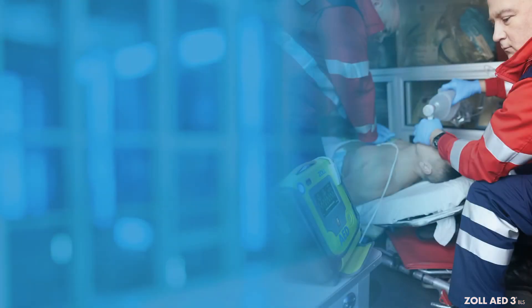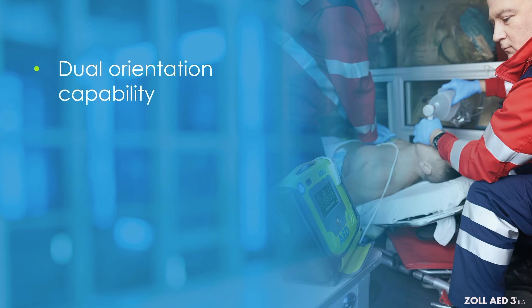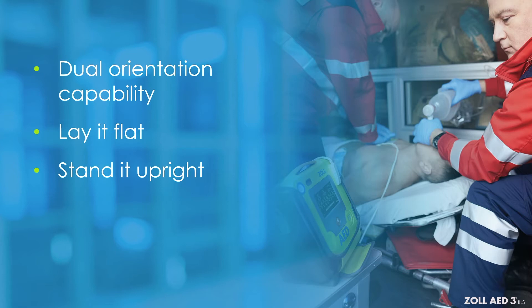Place the Zoll AED-3BLS next to the patient. As a reminder, the device has a dual orientation capability. It can be laid flat or it can be stood upright, as the need to view the screen from various angles can change during a rescue.